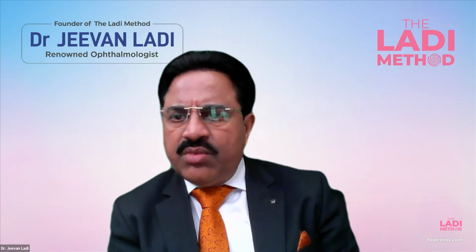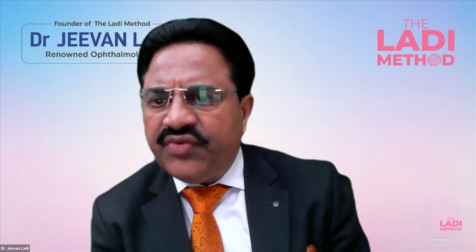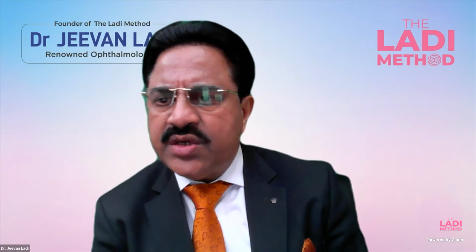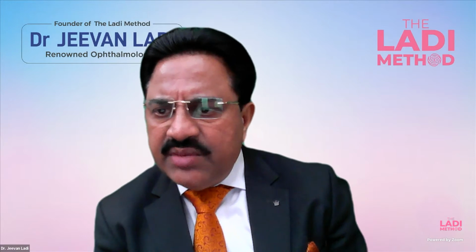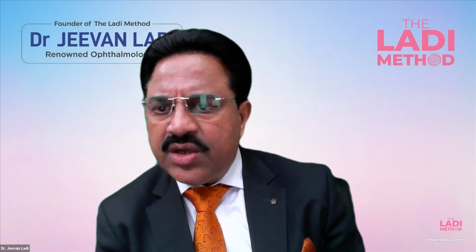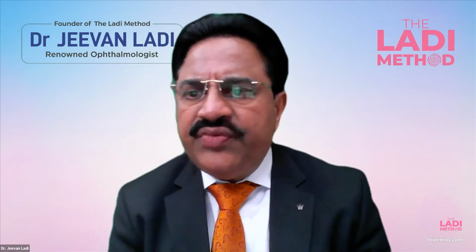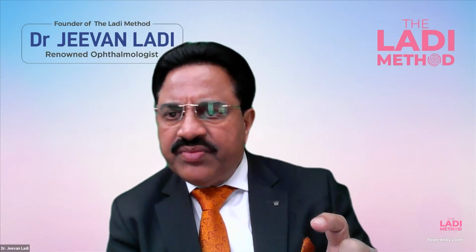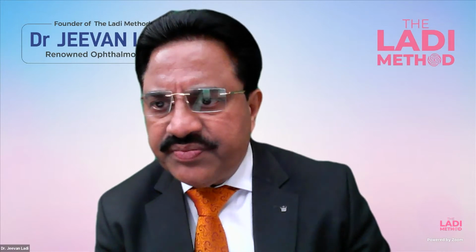There's a question from Dr. Mukesh from Pune, Maharashtra. Do we need to modify A constant for IOLs, as IOLs have different A constants for ultrasound and optical? If we are using the Ladi modification, then we need to stick to the optical A constant suggested by the company. Yes. If you see a box of a lens, it will have an optical A constant and an ultrasound A constant.